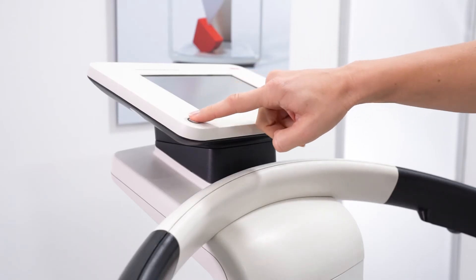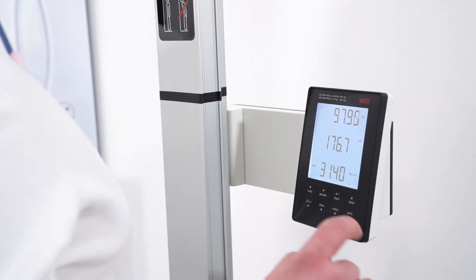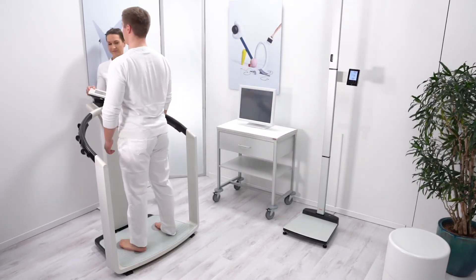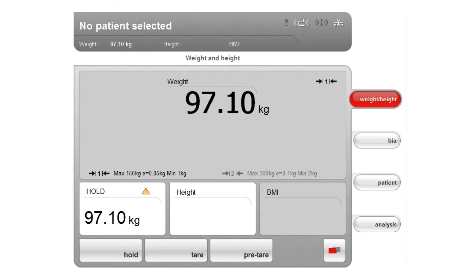Make sure that there is no load on the device, then switch it on and wait until the weight-height tab is active. The LED on the on/off button lights up white. First determine the height of the individual. With EMR-validated height measuring systems from SECA, the height can be sent directly to the Medical Body Composition Analyzer. Ask the test subject to stand on the device. The weight display flashes until the device has automatically determined the hold value. Wait until the weight display and hold value stop flashing. If a hold value cannot be determined automatically, a value can be saved using the hold key. Use the height sent by the measuring station or enter it manually. The BMI is automatically calculated and displayed.